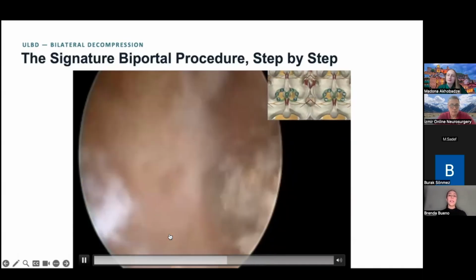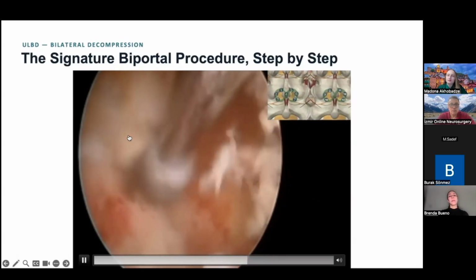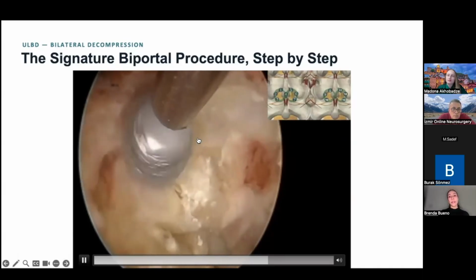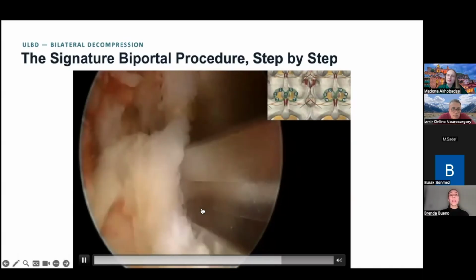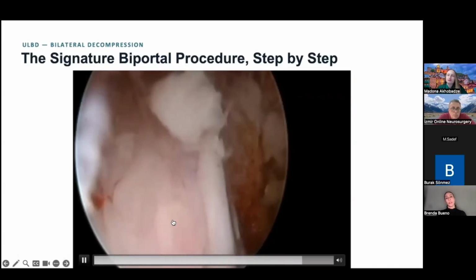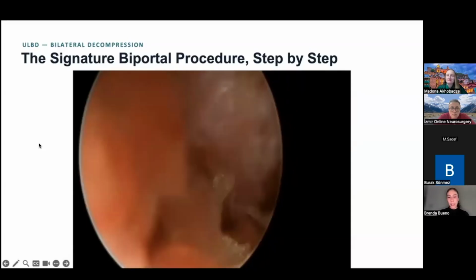I always do the same. And finally the lower ipsilateral lamina. After this, I clear my medial line, as you can see, and then go to the contralateral lamina, facet joints, and lower lamina. And finally, I remove my flavum and check that my decompression is complete, contralateral and ipsilateral. So this is the way I do my decompression.